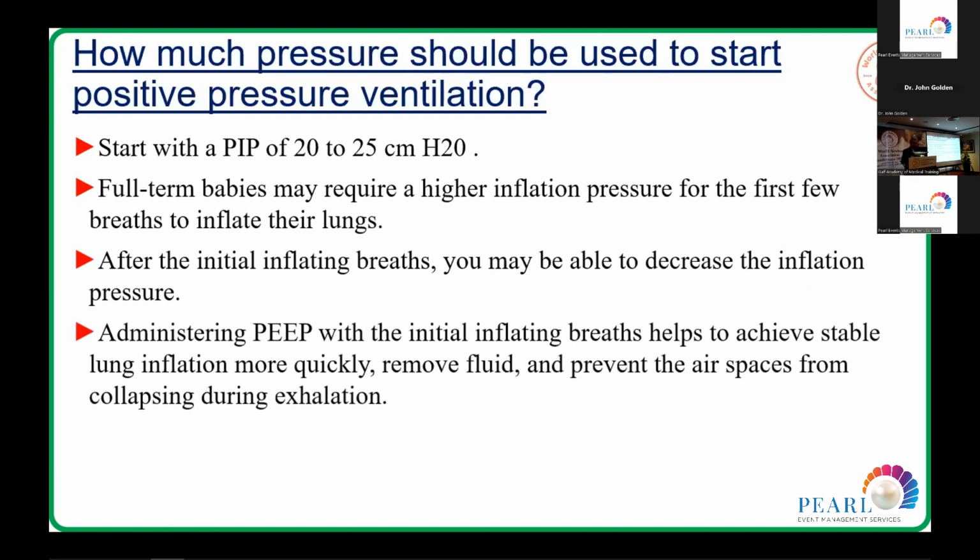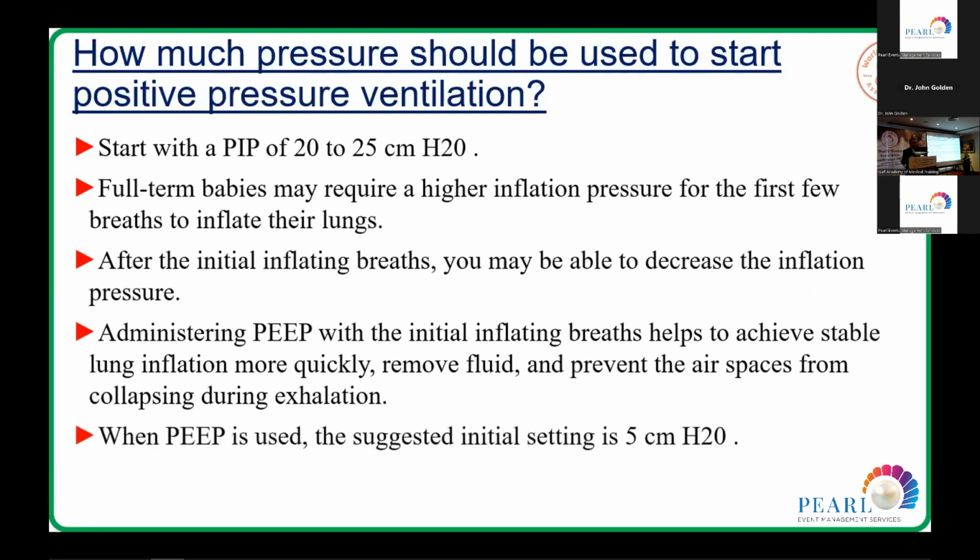Administering PEEP with the initial inflating breath helps to achieve a stable lung inflation more quickly, remove fluid, and prevent the air spaces from collapsing during exhalation. When PEEP is used, the suggested initial setting is 5 cm H2O.